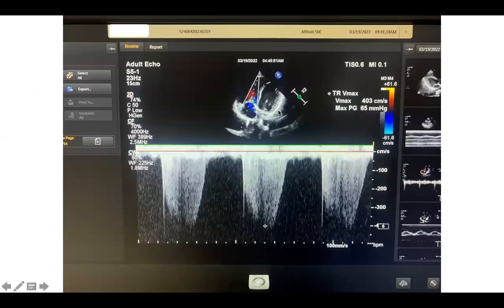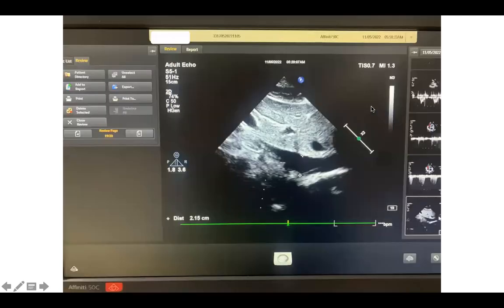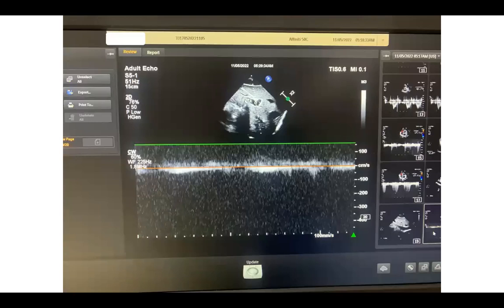The continuous wave over the tricuspid valve showed only mild tricuspid regurgitation, with a tricuspid regurgitant velocity approaching 4 — specifically 4.03 m/s — making a gradient of 65 mmHg. The IVC was dilated at more than 2.1 cm and did not collapse adequately with inspiration or sniffing. Continuous wave over the portal vein did not show any changes suggesting right-sided congestion.